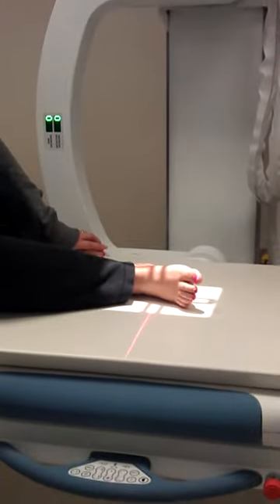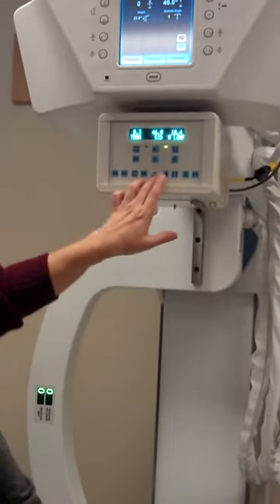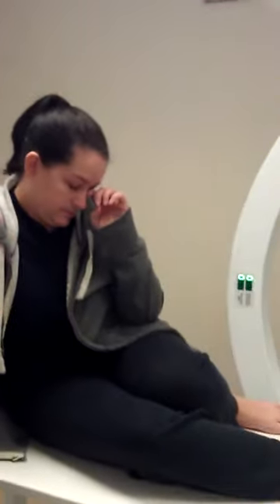She's almost there. It may just be a little maneuvering for the tip-fib and the foot, or the lateral foot. But on the tip-fib, you can't actually go over the side. What happens is when we did a 14 by 17 and we increased our SID, the light field was made bigger — it says to go up because of the way it diverges and it can get it in the joint. This one doesn't do that. So all we can do is just open it as wide as our collimation will go, because this is a 20 by 20. You're not going to clip anything by doing 20 by 20, because that's what the whole bucky will shoot.